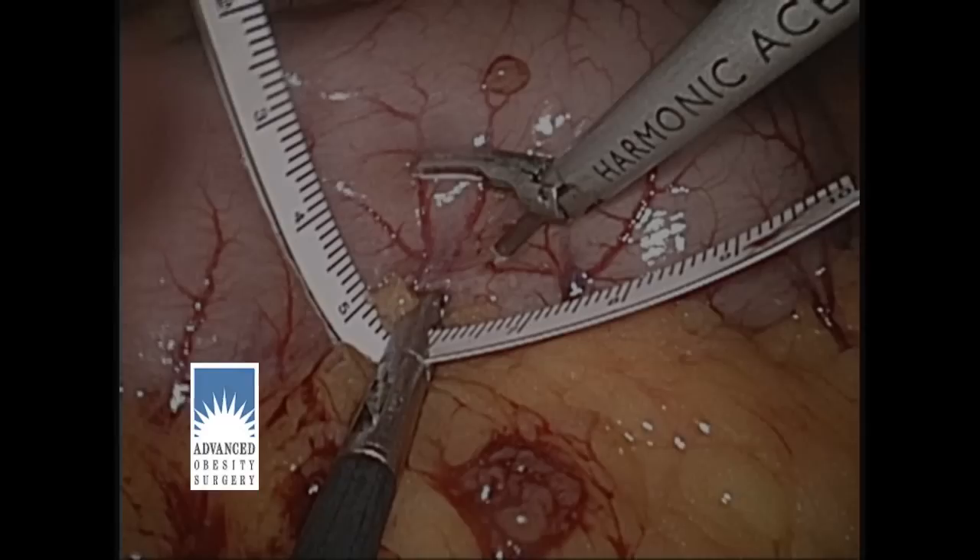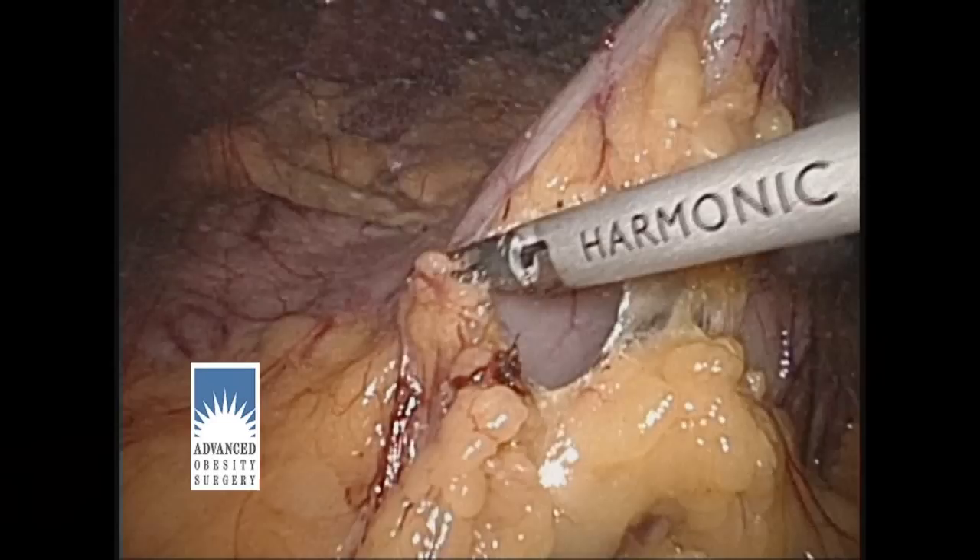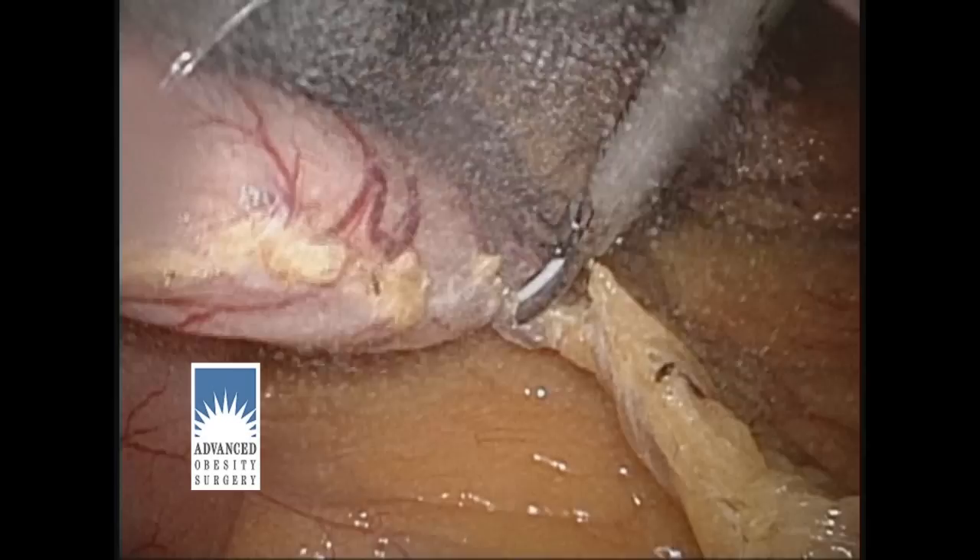We then start taking down the greater curvature attachments, which are the large blood vessels that feed the stomach laterally. This instrument does a very good job of controlling these blood vessels without bleeding. We take down these blood vessels from the pyloric valve all the way up to the very top of the stomach so that the lateral part of the stomach can be resected.